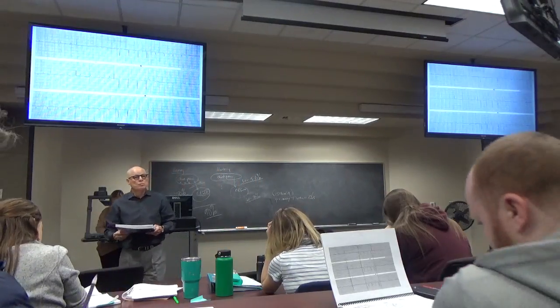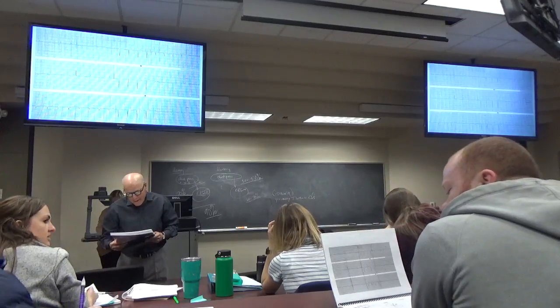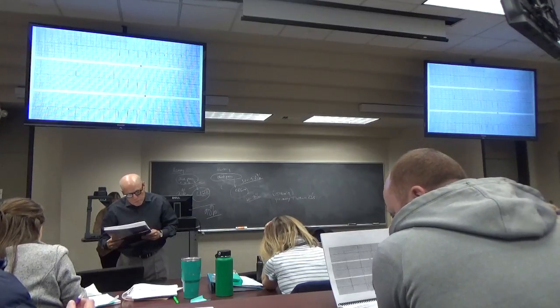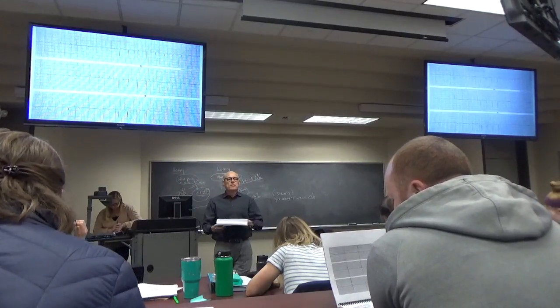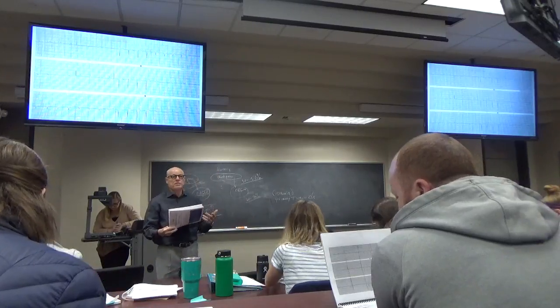Yes. I got that it was acute in my anterior septal. And then I was thinking probably an old inferior MI on that 2, 3, aVF. And why did you think it was an old inferior? Because the ST segment was flat. Because the ST segment's pretty much on the baseline.